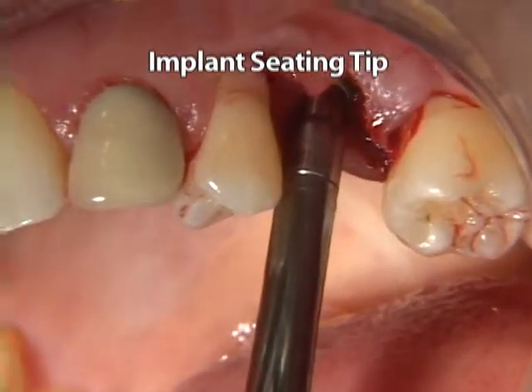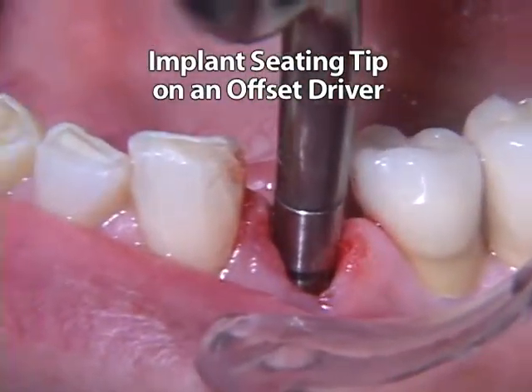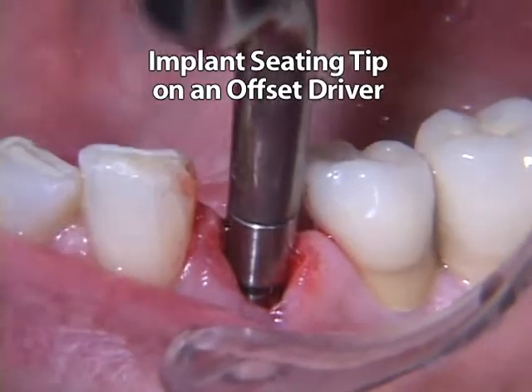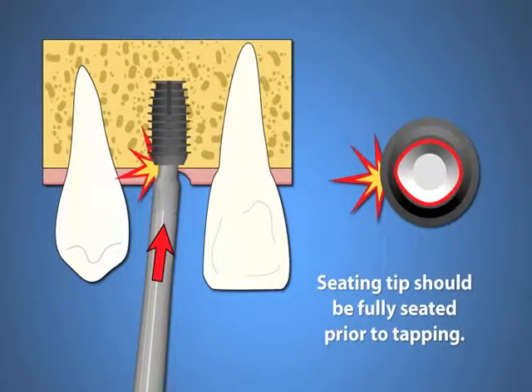When the seating tip is inserted directly into the well of an implant, it should be fully seated prior to the application of any force, since any distortion of the walls of the implant's well may prevent the proper engagement of an abutment's locking taper connection and possibly may result in the subsequent loosening of an unsplinted maxillary anterior abutment.